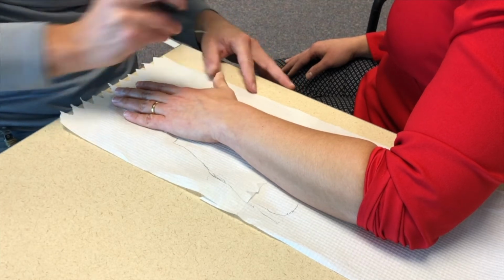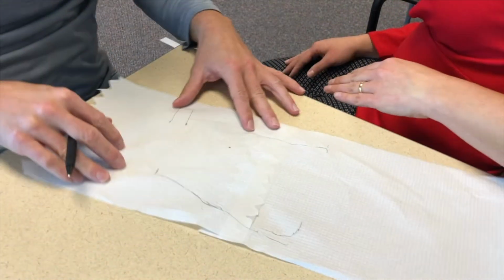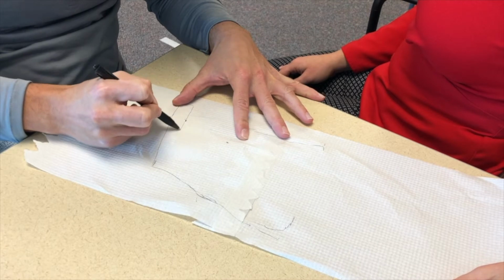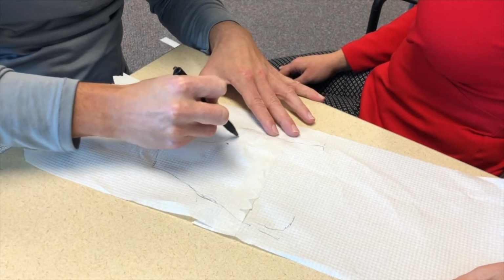Okay, so now we can draw lines here for our tab. We can have the client remove their forearm. Then all we essentially do is connect our dots.